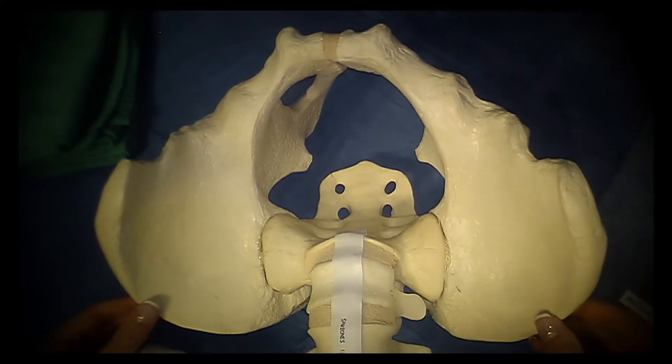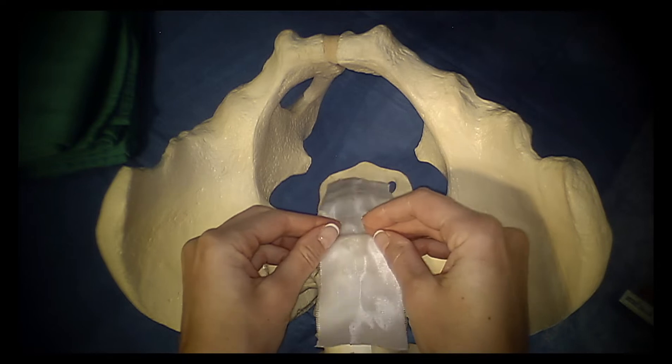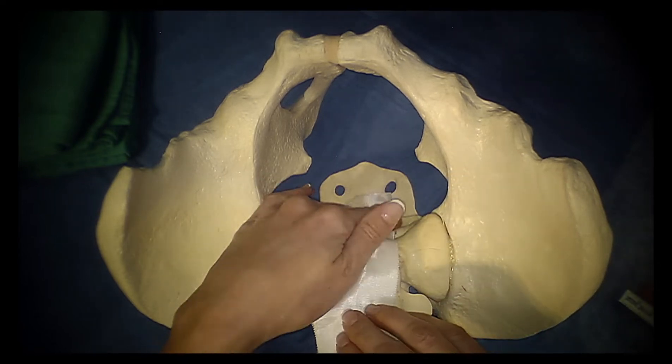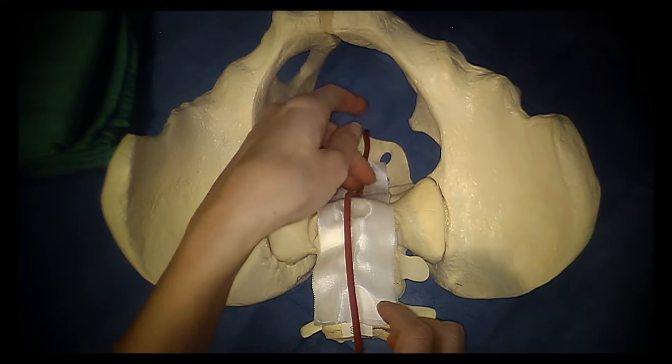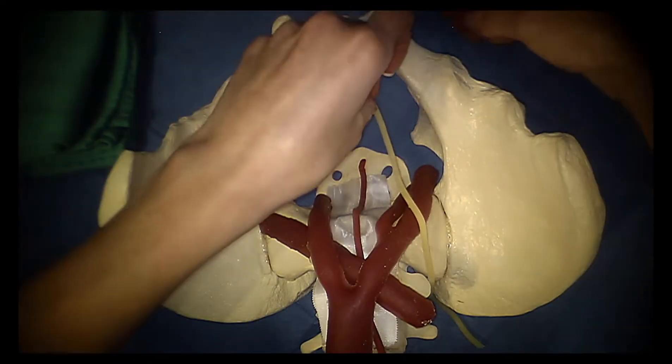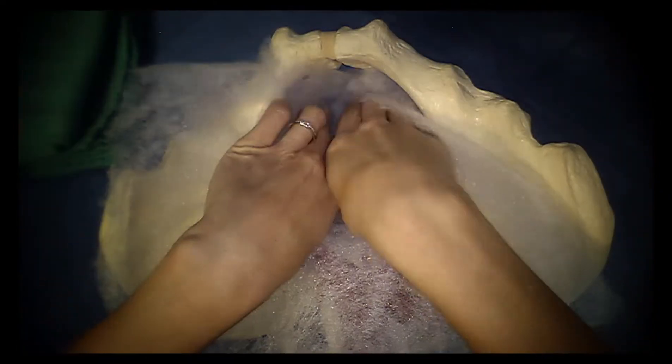First, we obtained a bony pelvis, including L4 and L5 vertebrae. The anterior longitudinal ligament was created by placing a piece of surgical tape over the presacral space. In this image, you can see the middle sacral artery, left common iliac vein, aorta and its bifurcation, and ureter.